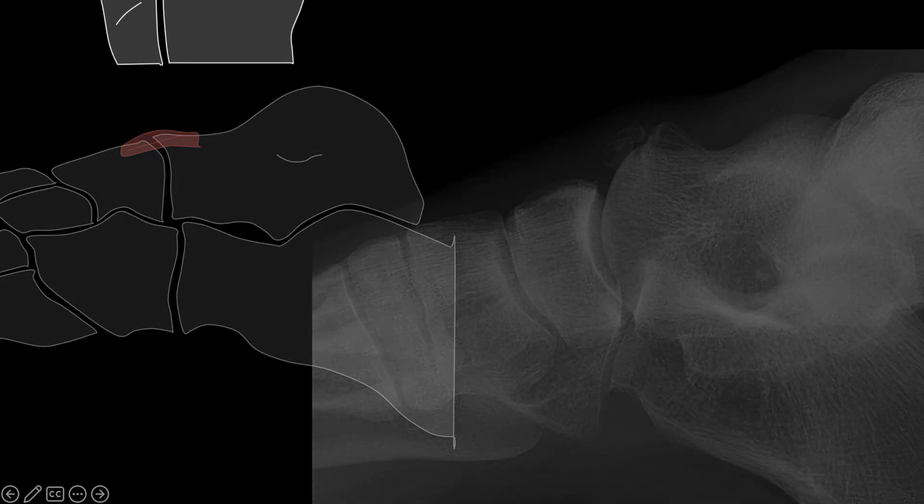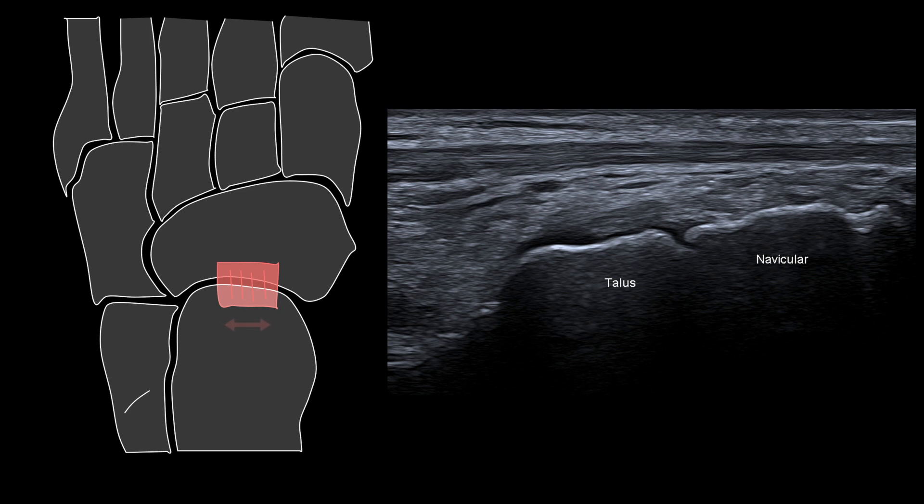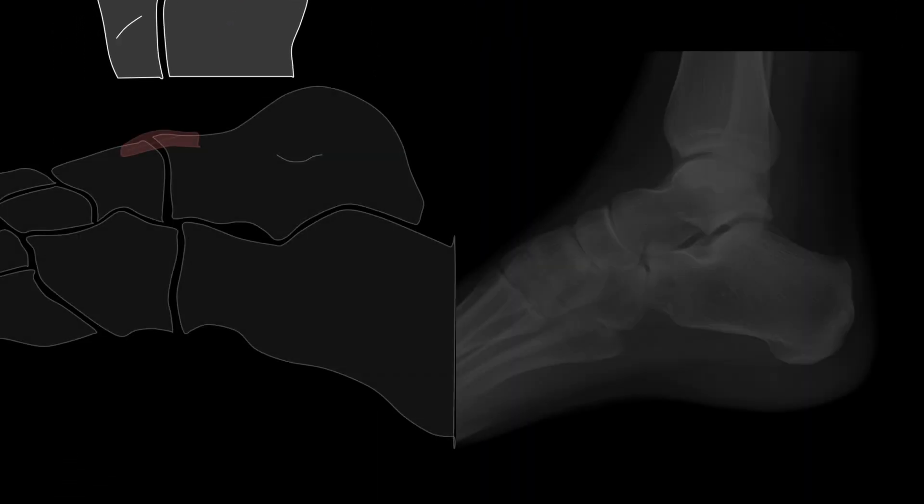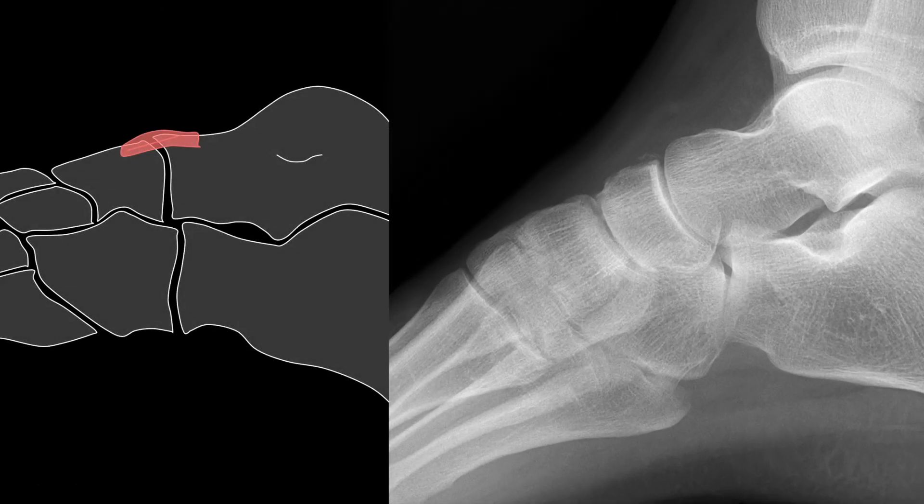The next pitfall to be aware of is the width of the talonavicular ligament. Here we can see the medial aspect of the ligament — it appears normal and intact — but at the lateral margin we are seeing a navicular avulsion fracture, which is confirmed on the subsequent x-ray images.